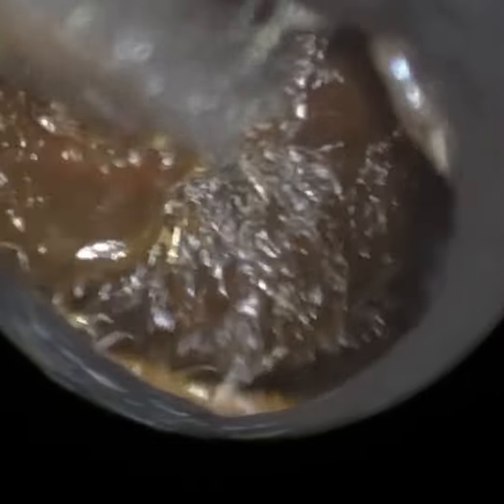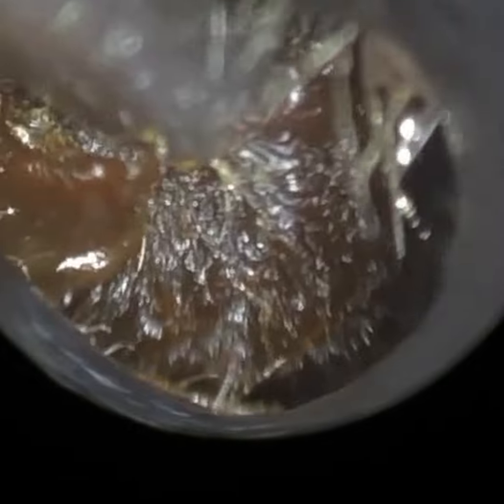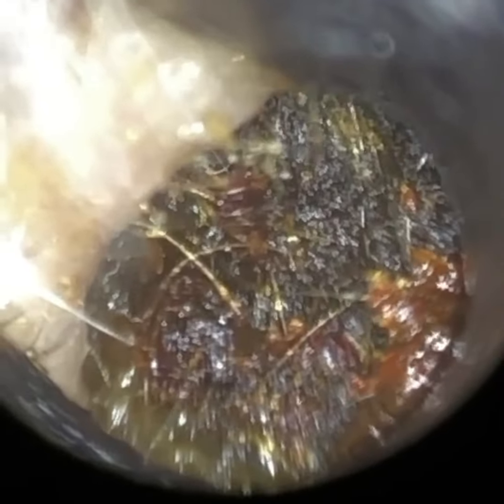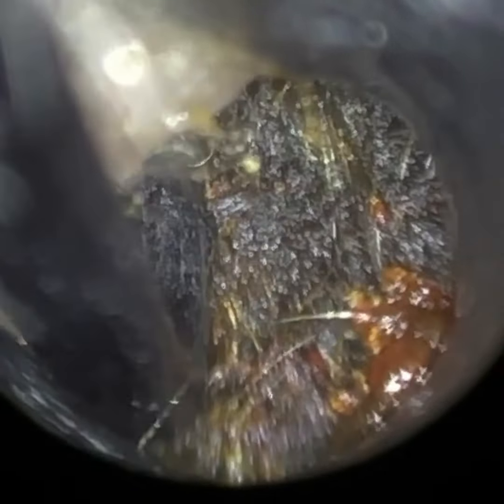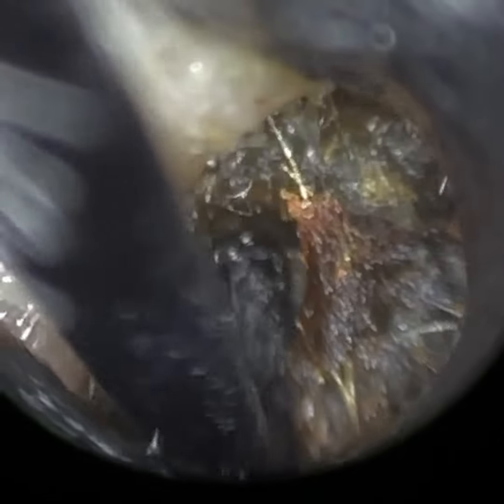It'd be interesting if any viewers are using loops, a microscope, or any other device to remove wax other than the endoscope — just drop a comment and let me know how you feel the view compares to your current technique. I'm just scanning around the top of the ear, adjusting the focus, and gliding in with the hook, getting to the roof of the ear canal and embedding the tip into the core of the wax.